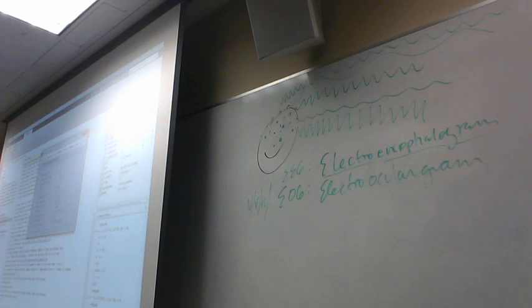So, if we're graphing this type of frequency, a lot of times they graph these things with color maps or heat maps. We'll get into that in a little bit more detail as the class goes along. But you'll see this patch of 60 hertz that sticks out. Maybe I should just color it this way so it doesn't look like oscillations. So if anywhere on this heat map that's colored represents frequency of activity, and anywhere that's not colored is neutral, so we have empty space here. We're just showing 60 hertz line noise. So you might have noise like that. That's also something that might be recorded, absolutely.